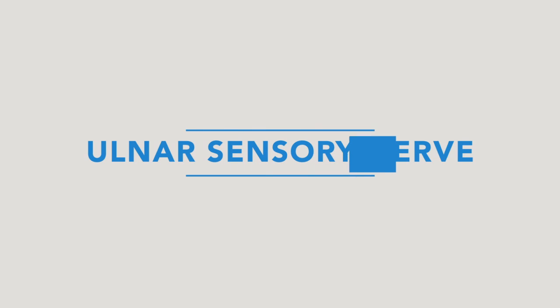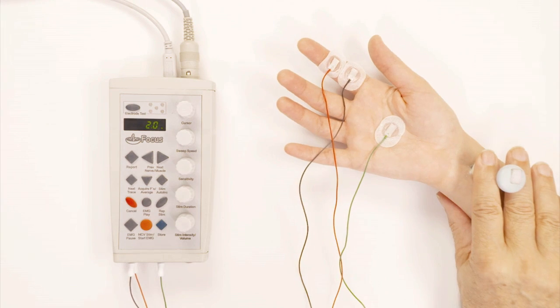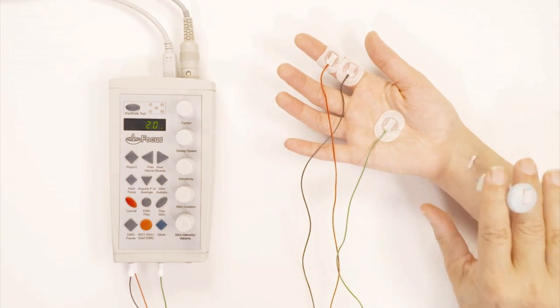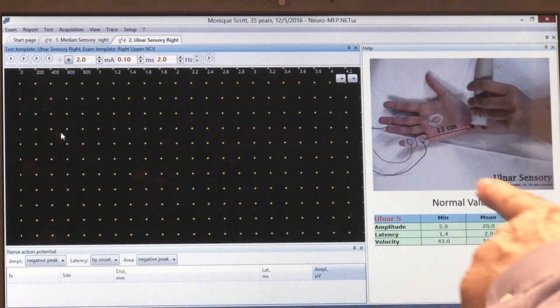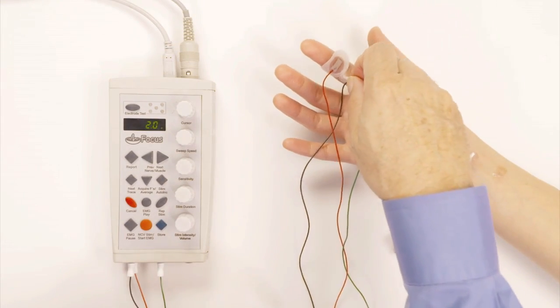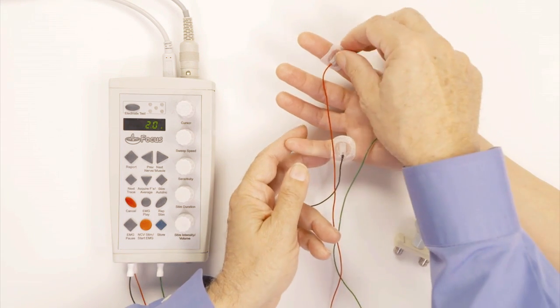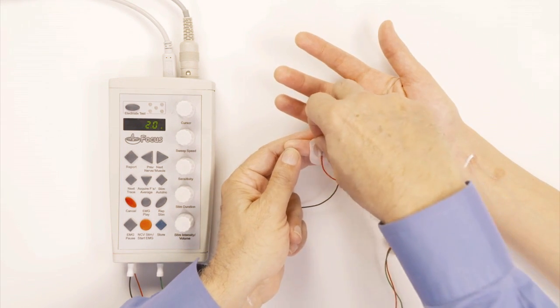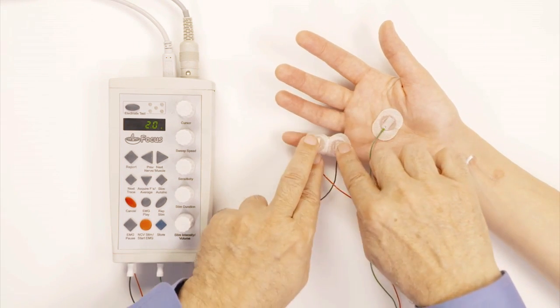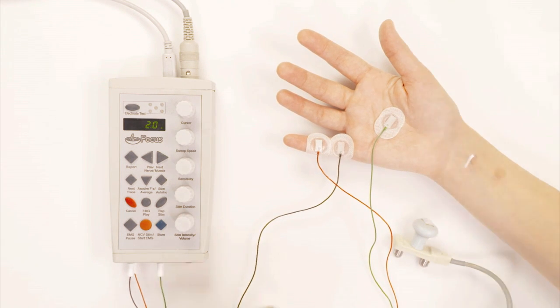So the next nerve that we're going to study is the ulnar sensory. You see from the setup that we're going to put the electrodes on the baby finger right here. I'm going to take the electrodes from the index finger to put them on the baby finger like this. And now you see where they are. I leave the ground exactly where it is.